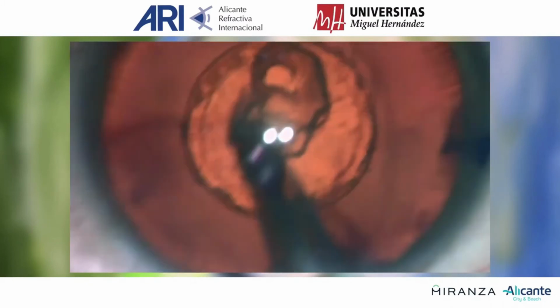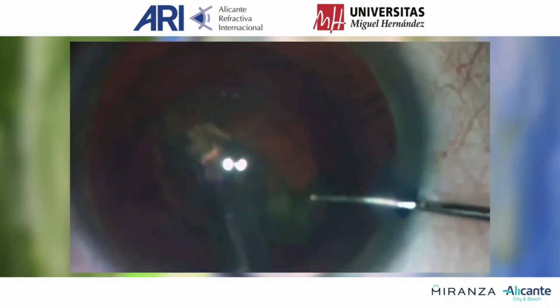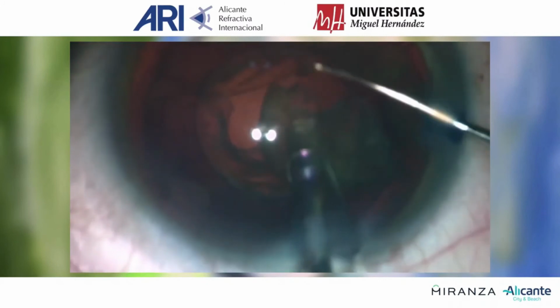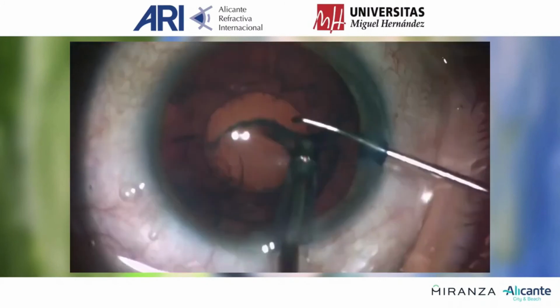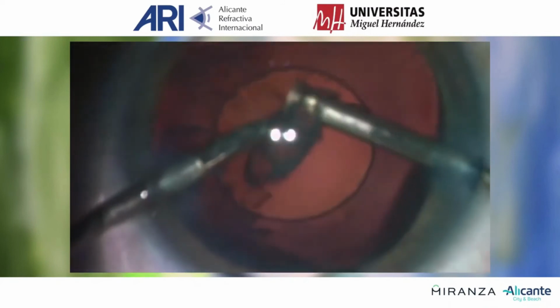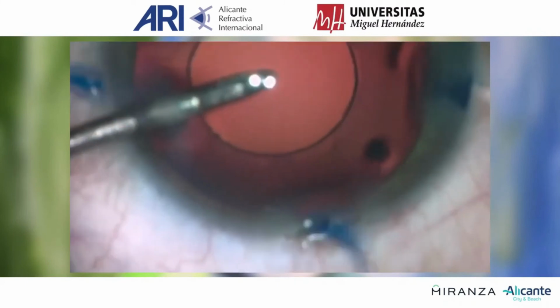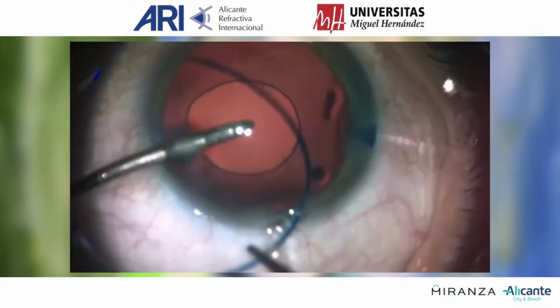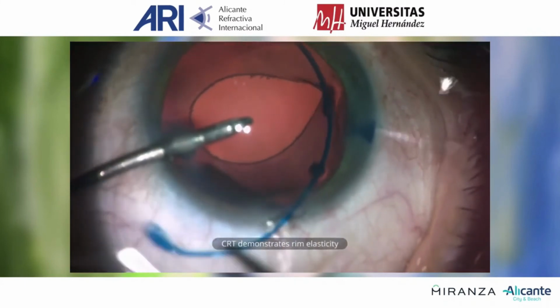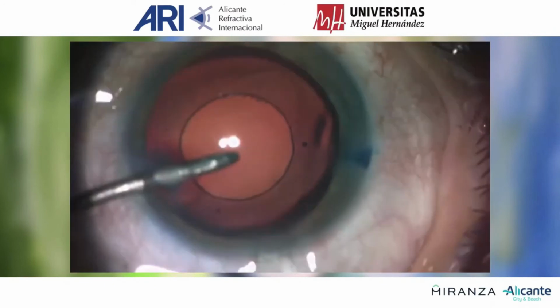The central capsular disc is aspirated directly by the phaco tip. The cataract is removed through capsulotomy with the blue stained edge, which increases its visibility. The pressure of the capsular tension ring over the capsulotomy edge demonstrates its reliability and strength.